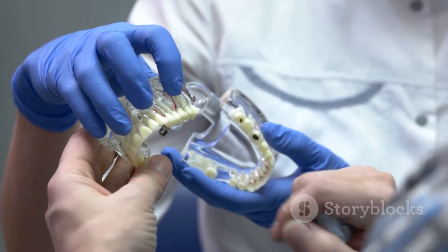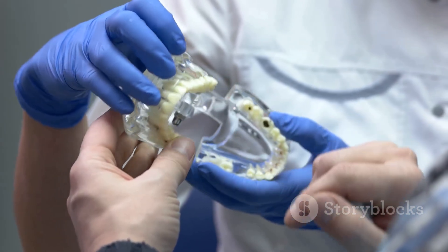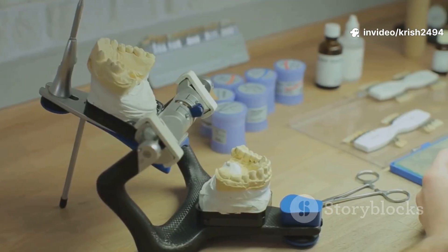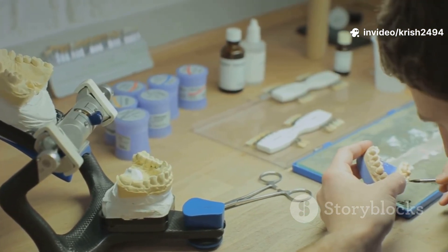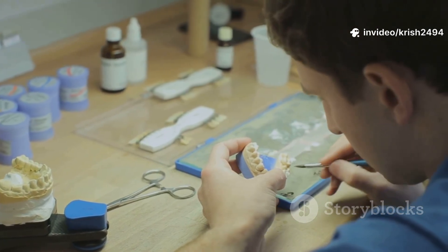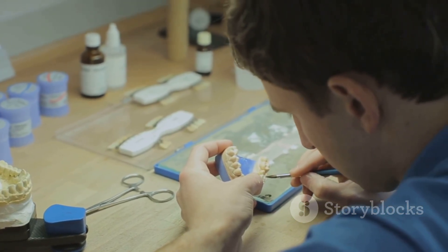Jaw relation records come next. The dentist adjusts the wax rim in your mouth to set your bite, midline, and smile line. They record how your jaws relate, sometimes using a face bow for extra precision. This info gets transferred to a device called an articulator, which mimics how your jaws move.